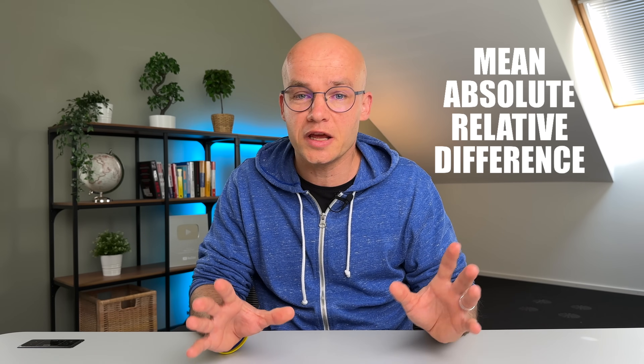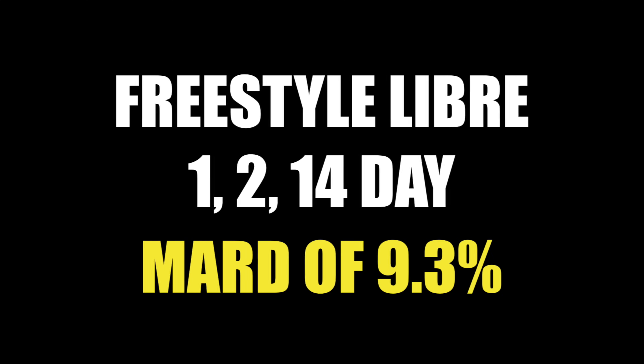Difference number 6 is how accurate these sensors are. A common way to measure CGM accuracy is mean absolute relative difference, or MARD. The lower the MARD, the more accurate the CGM — just like golf, where a lower score is better. Older models like Libre 1, Libre 2, and Libre 14 days had a MARD of 9.3%. Freestyle Libre 3 has a MARD of 7.9%, the lowest of any CGM currently on the market. So Libre 3 is theoretically a tiny bit more accurate. But for a reality check: I've used all these CGMs extensively and you won't actually tell the difference in accuracy between Libre 2 and Libre 3 in practice.